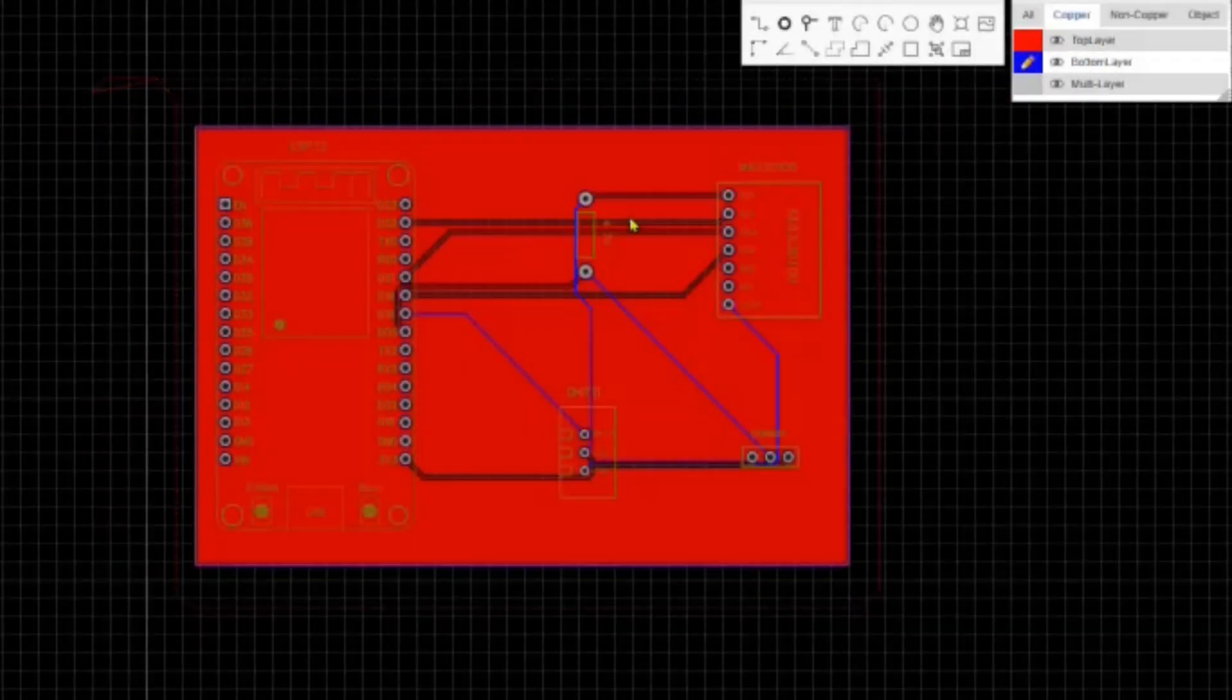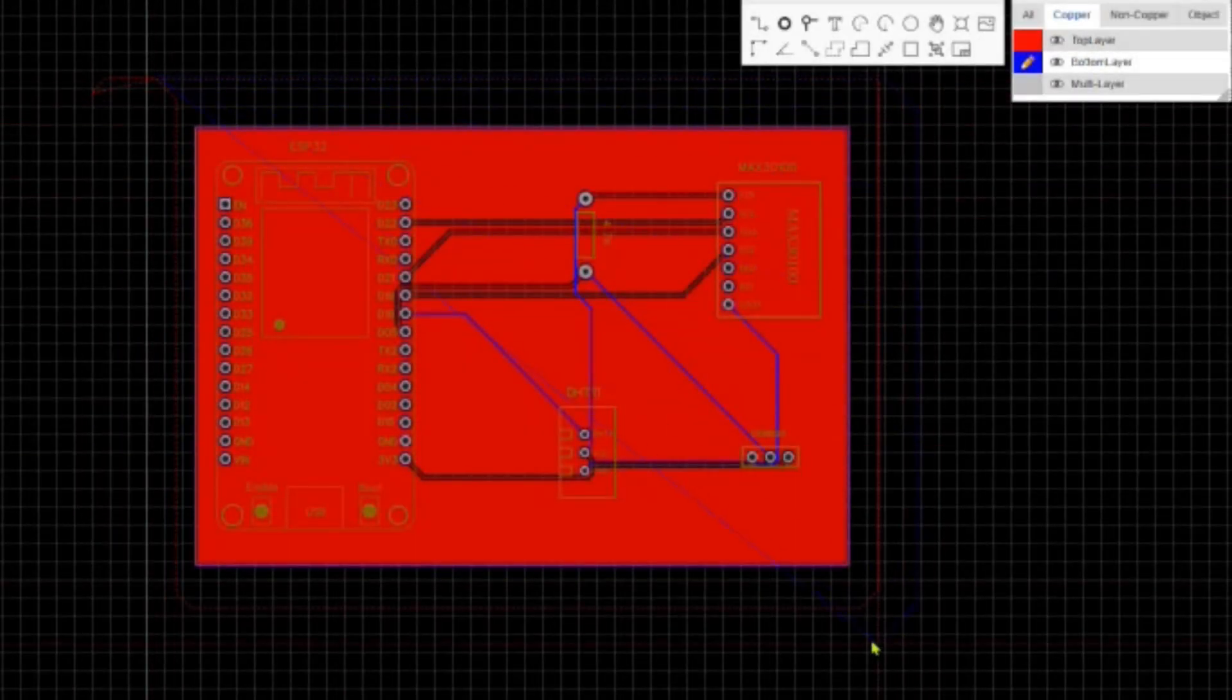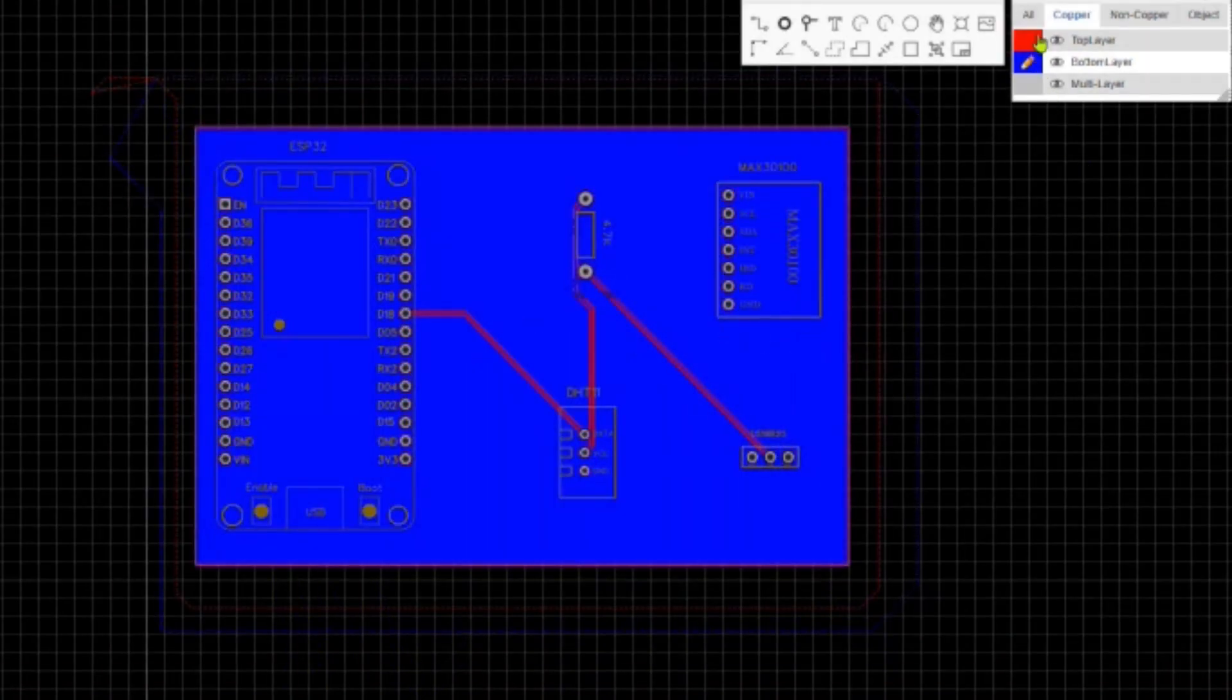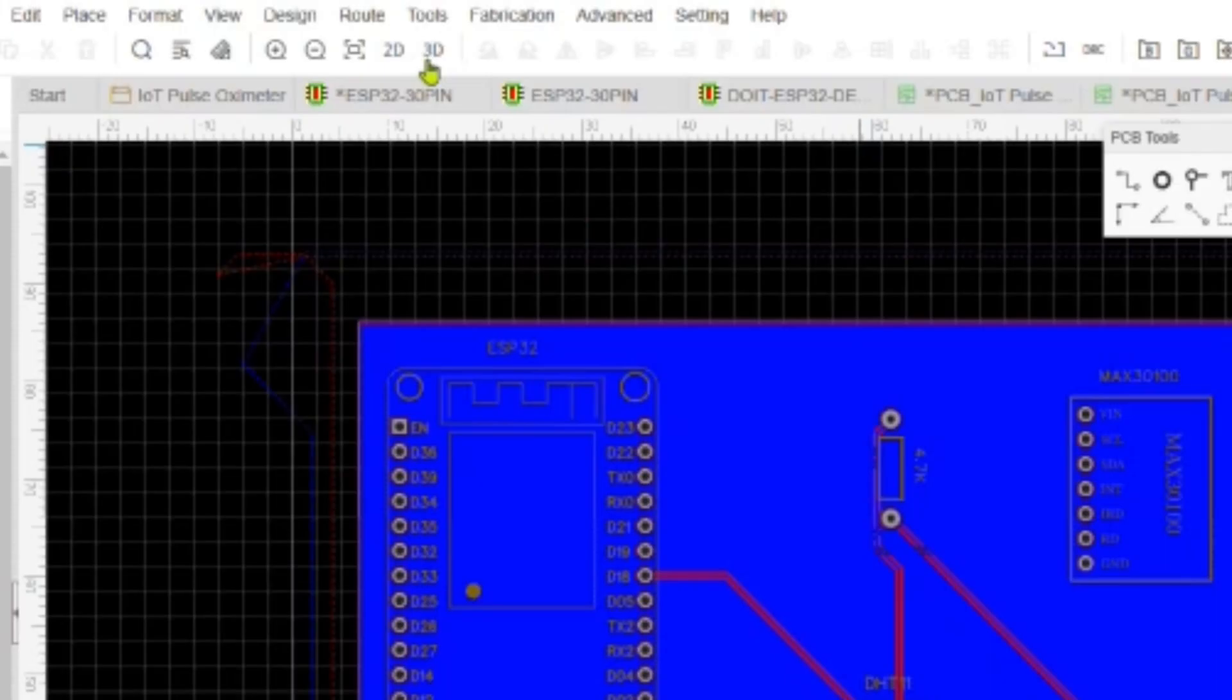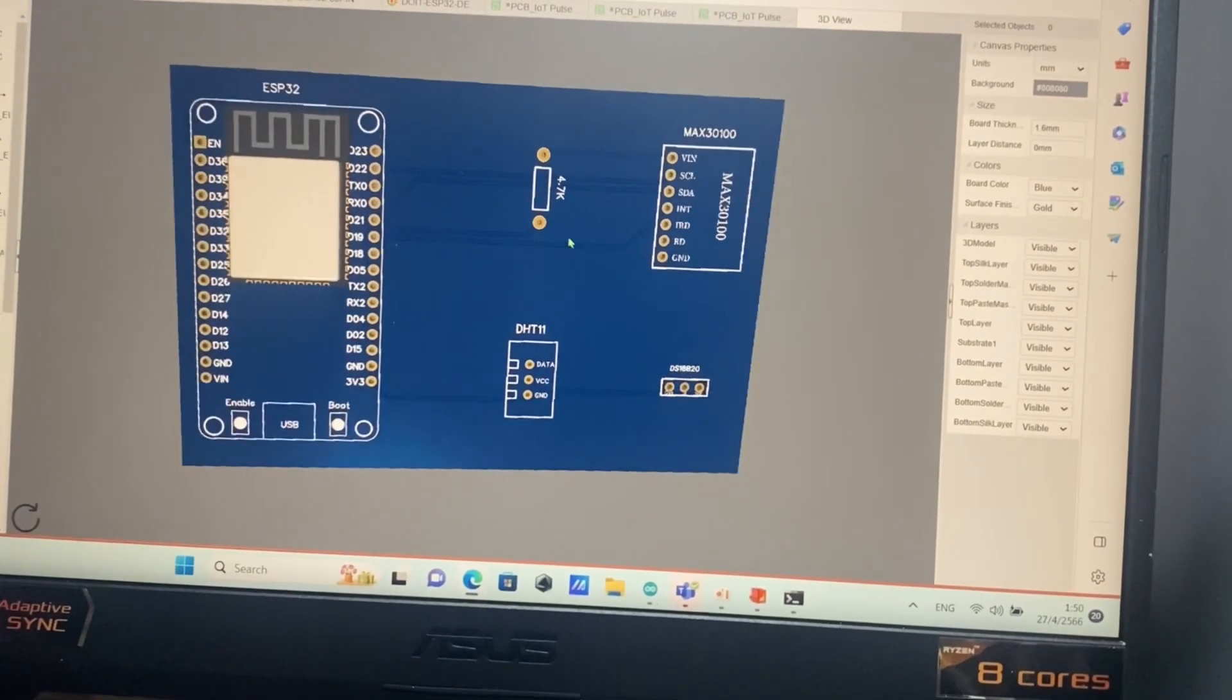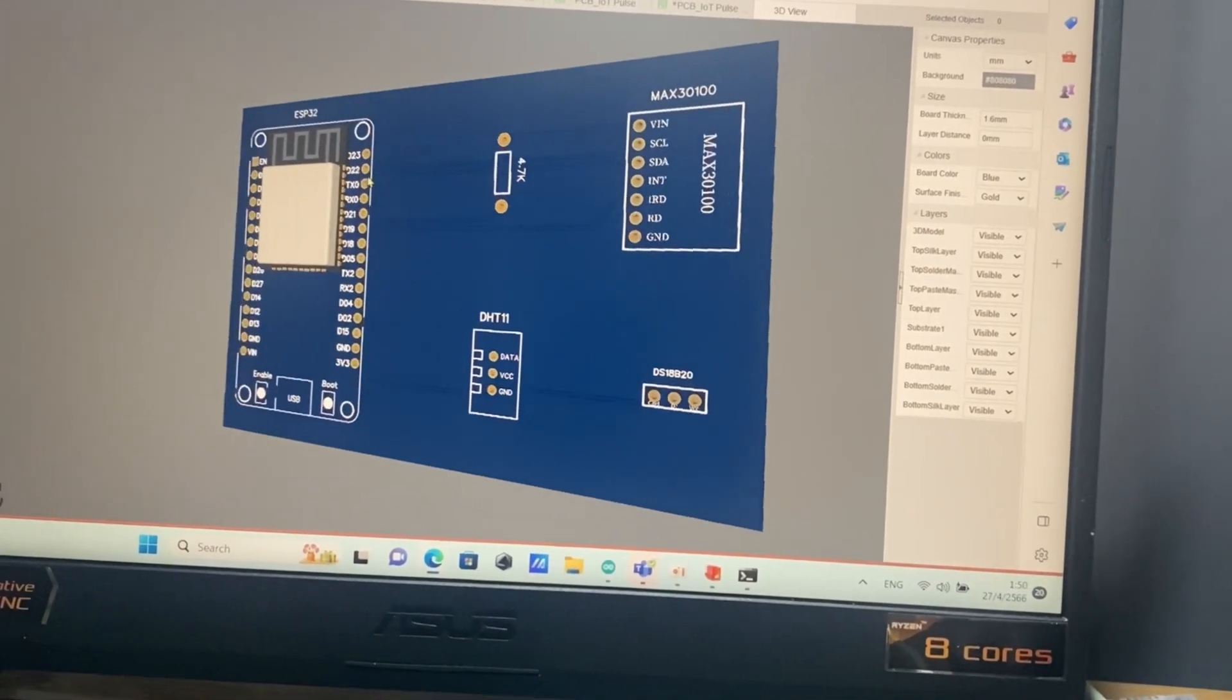Add copper on the bottom layer and the top layer. So let's view it in 3D. You can get the PCB board. In the next few days, we will take a look at it.